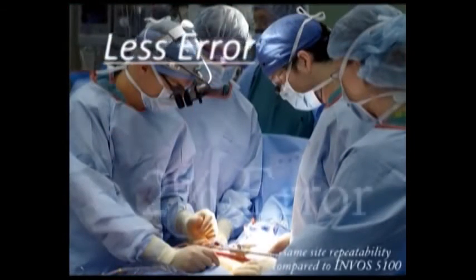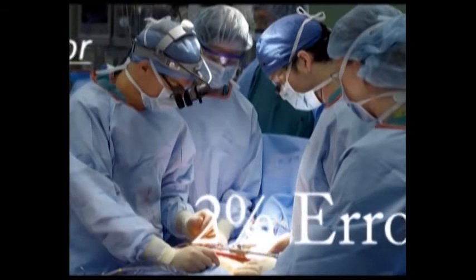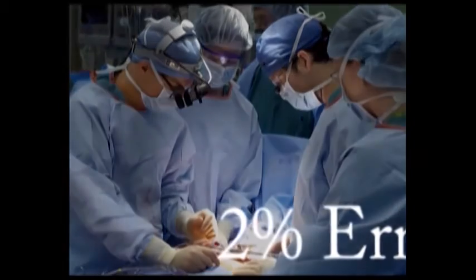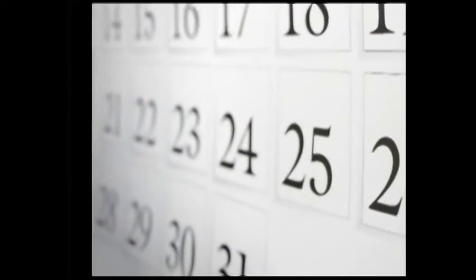Because T-Stat is broadband, multiple independent studies have proven that T-Stat has significantly less error than other tissue oximeters. As a result, T-Stat values are remarkably consistent from patient to patient. T-Stat sensors can be moved or repositioned as required without compromising baseline accuracy. All T-Stat sensors are approved for up to 30 days of continuous use. You don't need to change them every day, as is required for some other sensors.